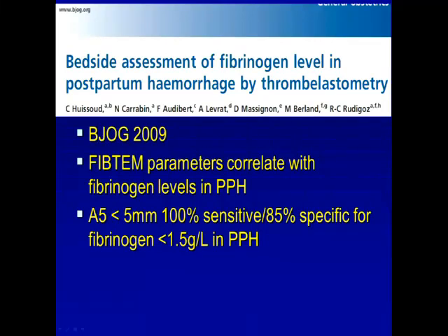Dr. Kerr, are there any studies, as far as you know, looking at centers or areas which have introduced prophylactic TXA, for example, as we have here with the ambulance system for major trauma, who have then looked at the before and after ROTEM results to see if fibrinolysis is less of a clinical issue in major trauma patients who get prophylactic TXA?